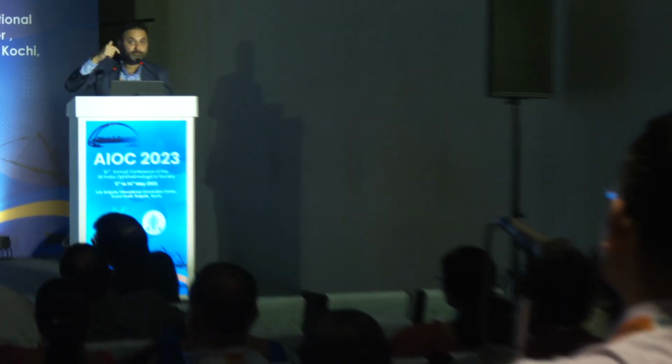Typically the patient was acutely symptomatic when she came, with a 7-year follow-up. She is an anesthetist, faculty with us at PGI. She's HLA-B27 positive, so she has had fundus examinations for a long time. She did not have any PED. She suddenly got a PED, and she was symptomatic, but with her refractive correction she got 6/6 at that time. Did not have any fluid over the apex. None of the FA, ICG, OCTA showed a membrane in either of the eyes. She was followed up for 7 years, with yearly FA, ICGs and OCTAs, and it hasn't shown a membrane.